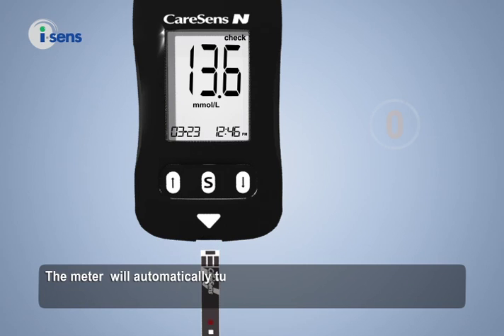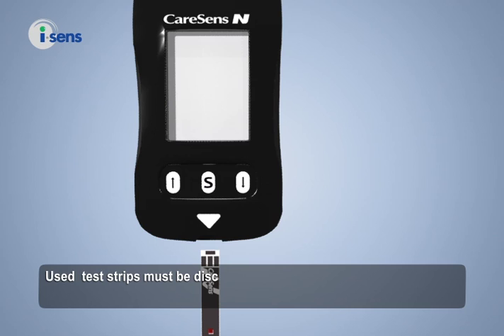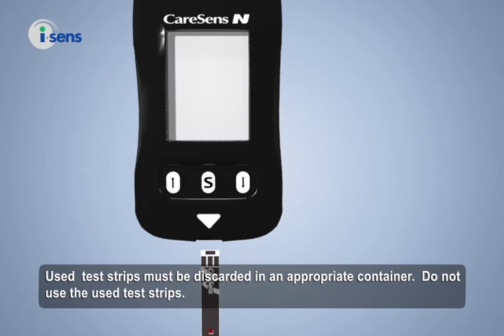The meter will automatically turn off after 3 seconds of taking out the strip. Used test strips must be discarded in an appropriate container. Do not reuse used test strips.